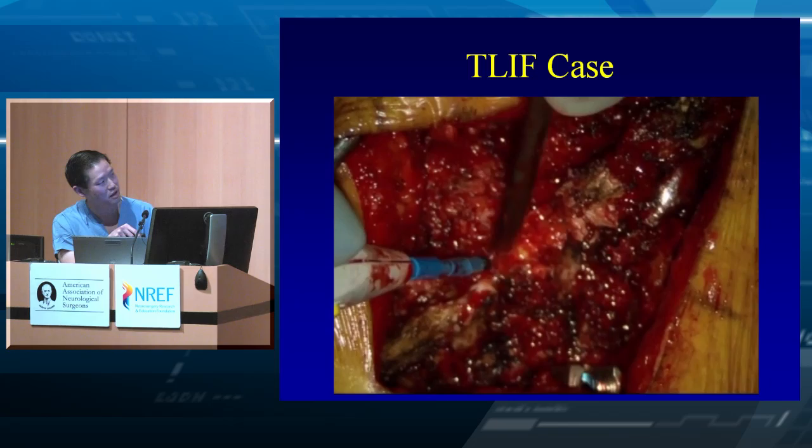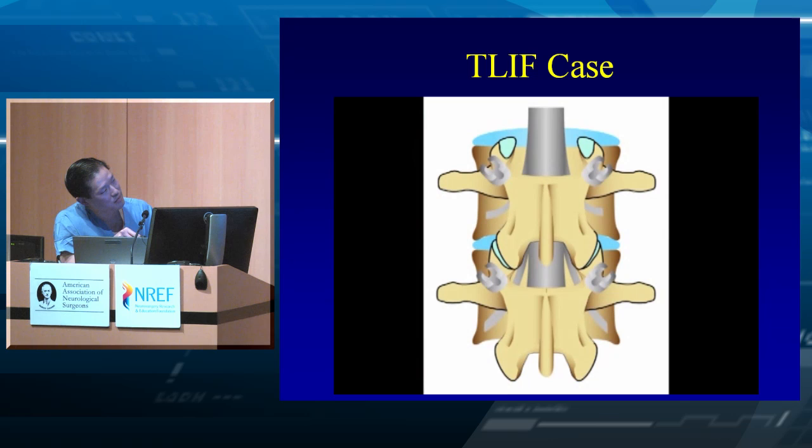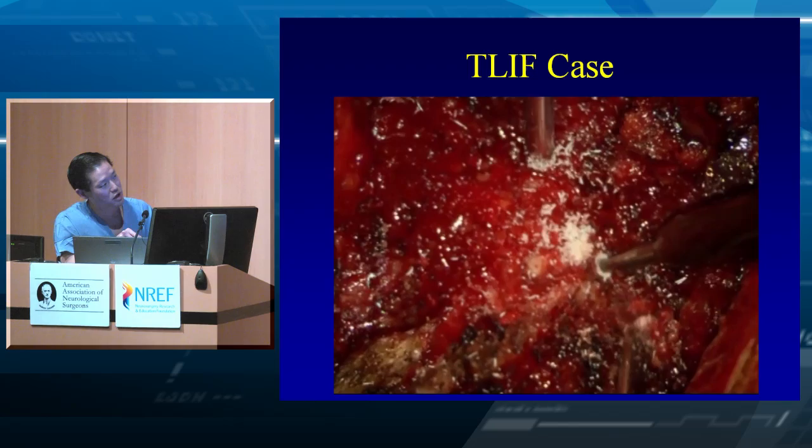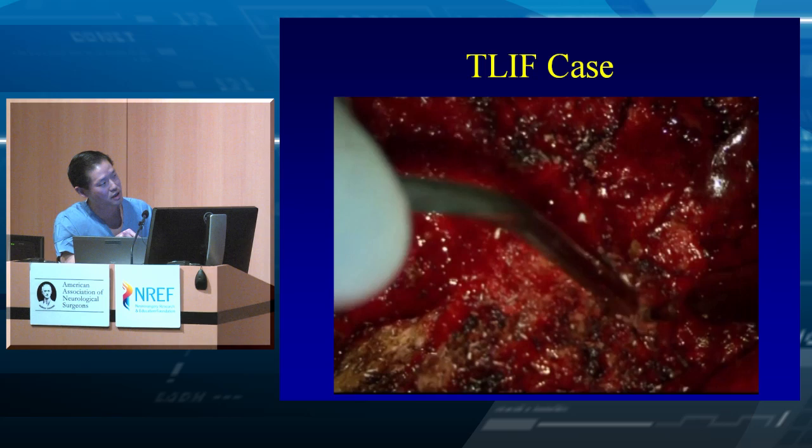And I don't know if this projects well, but basically a laminectomy has been mostly done, and we're going to make this transverse cut through the pars interarticularis. So at L4-5, it's the L4 pars we're going to remove. And so all you do is essentially the laminectomy, make a transverse cut through the pars interarticularis with the drill. We use an osteotome as well. It's fairly quick. So this is the pars right here. So remember, this is cranial, caudal, right side. We're just cutting through the pars here. And that disarticulates this inferior articulating facet. So the inferior facet of L4 can be removed fairly easily, and it can be removed in block. And we usually save it as autograft bone.